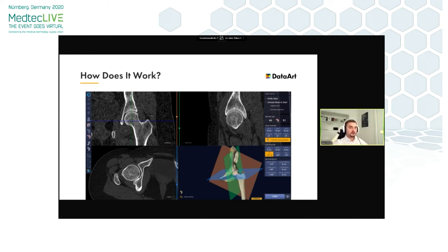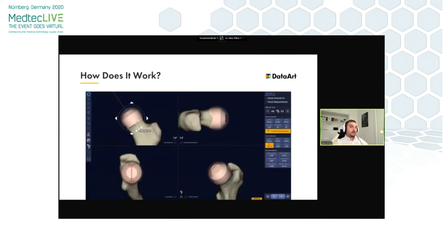On this screenshot you can see a regular CT view where the 3D model views slice it with respective cut planes. When you navigate through CT layers, you can see how those cut planes move on the bottom right screen. This particular mode is intended to perform examination of the case both for CT and 3D model. In this mode, a user can perform placement of the femoral head — it can be done by moving the head with your computer mouse on any desired window, or by tuning parameters on the right panel with small increments.